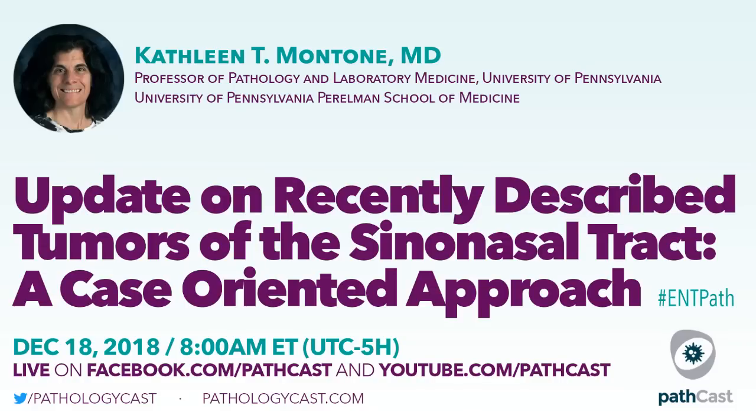In these lesions it should be maybe just patchy positive. If it's strongly positive, you may want to think about a tumor with squamous differentiation, or a Ewing family tumor, as we have seen.